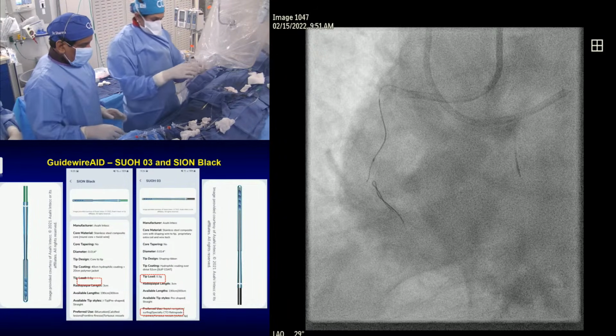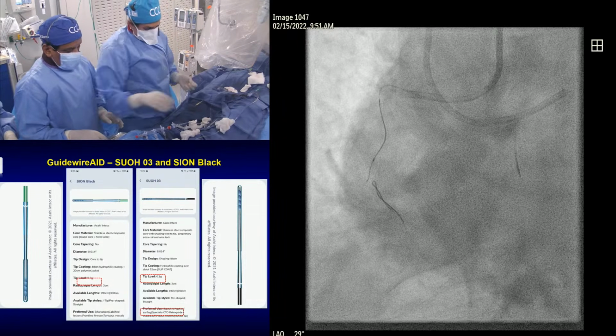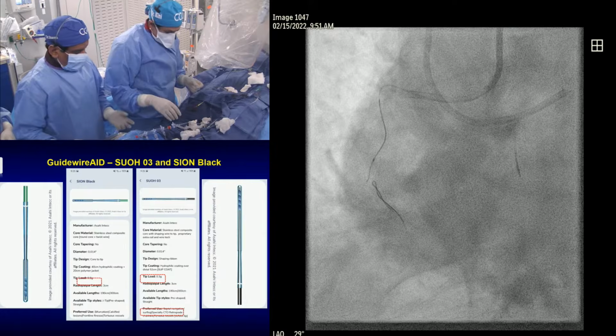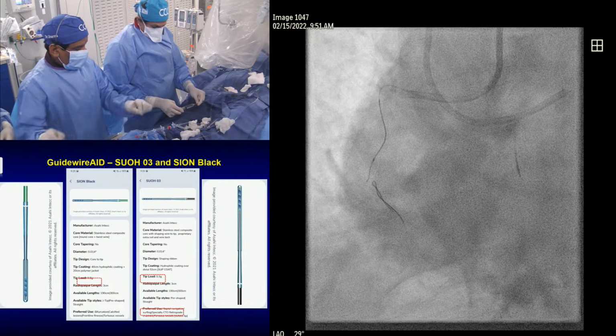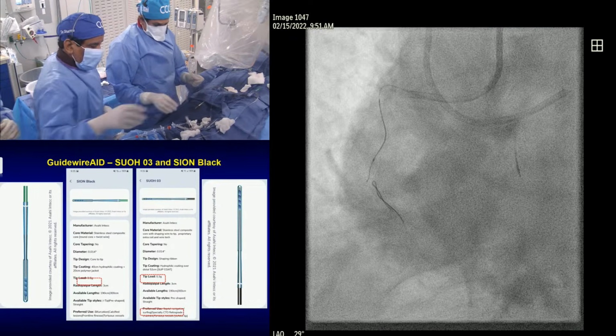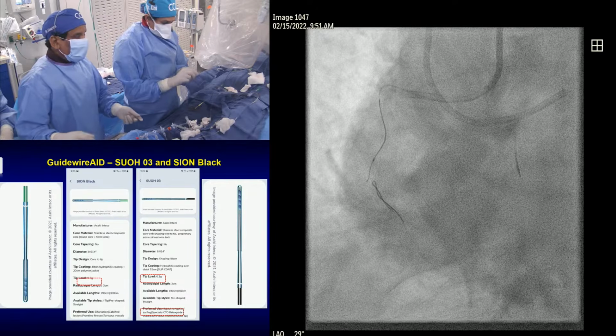All right. What, Estato? 14 or 20? 20, not 14. Okay. 20 and 40, they come 20 and 40. Hornet is 14. All right, let's see. To make that connection.